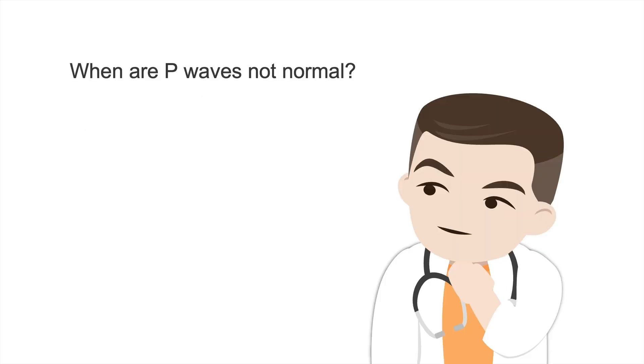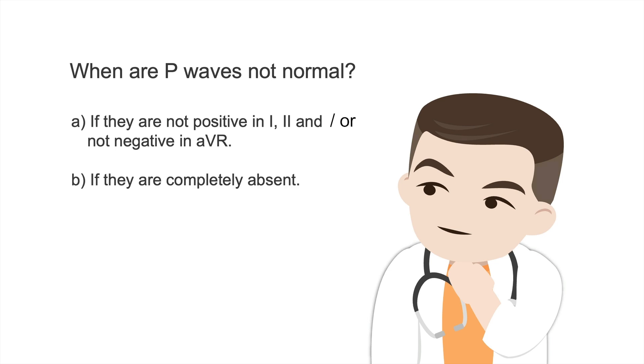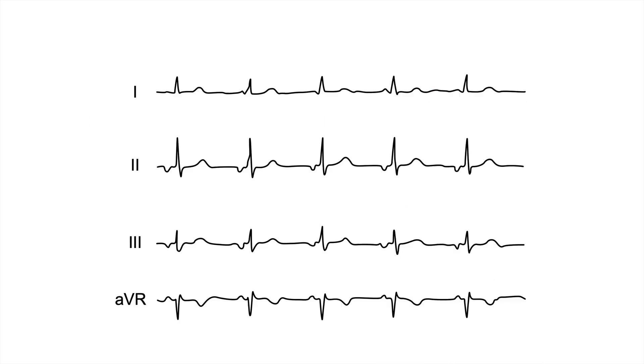Now let's look at a situation when P waves are not normal. Well, first of all, P waves are not normal if they're not positive in leads 1 and 2 or not negative in AVR. And they're also not normal if P waves are completely absent. Let's have a look at situation A for a moment. Look at this example.